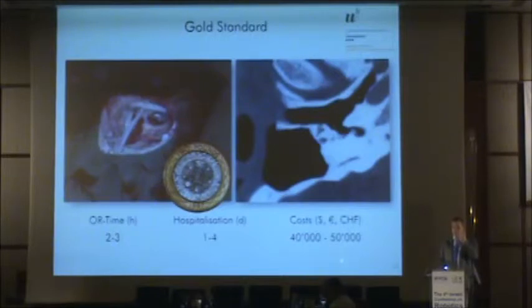This is a structure that controls the muscles and the senses in the face. You do not want to screw with the facial nerve. What you see here in the picture is the size of what's called a mastoidectomy, the removal of the bone behind the ear that you have to do in order to place a submillimetric electrode.